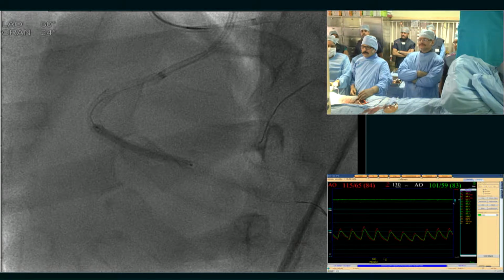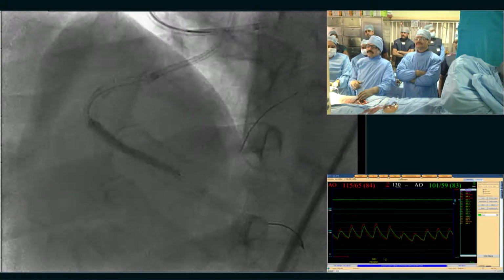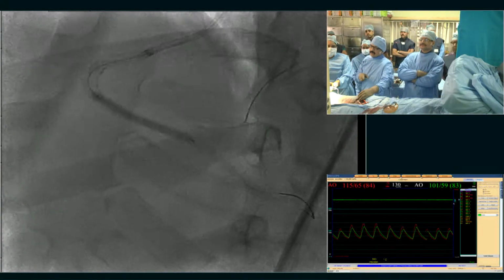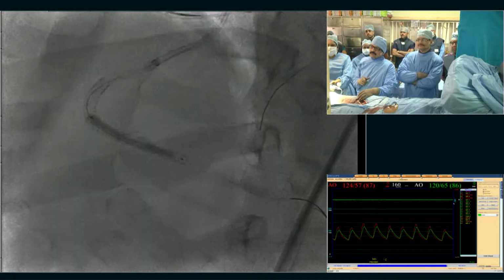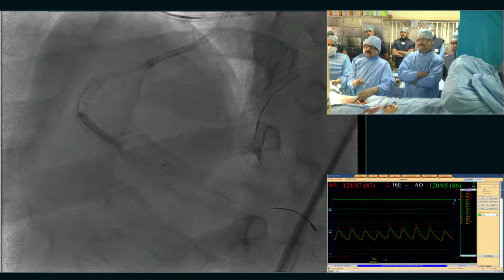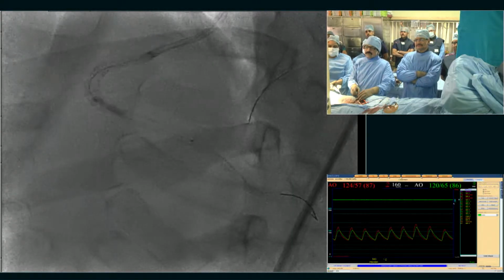I think you are absolutely right. There is some staining on the PLV. Yes, the PLV is closed in the ISR, but it is retrogradely filling from the left system. So whether we should open it antegrade with a Crusade is another step. We will discuss that.